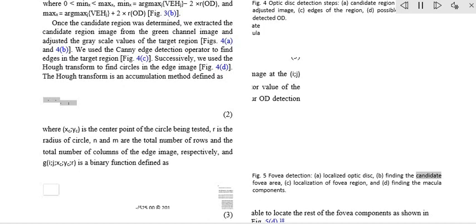One is called the inferior, superior, nasal, and temporal (ISNT) quadrant features, and the other is the Zernike moments, which are expected to have high descriptive power. Moreover, the ISNT quadrant features and the Zernike moments describe the local and global properties of the vessel structure, respectively. Our goal is to identify the retinal images, as well as the non-retinal images obtained from fundus cameras. It is obvious that the texture of both types of images should be different from each other.